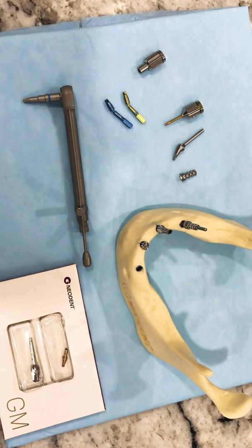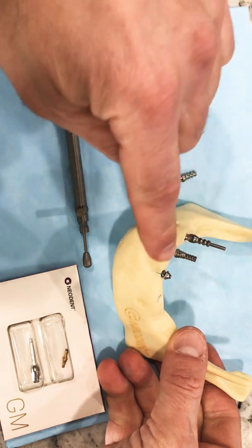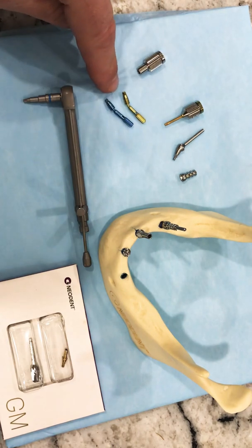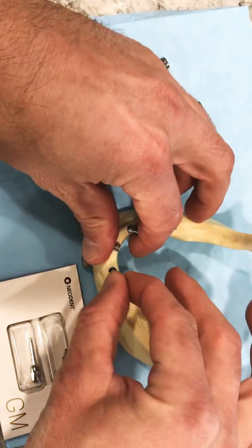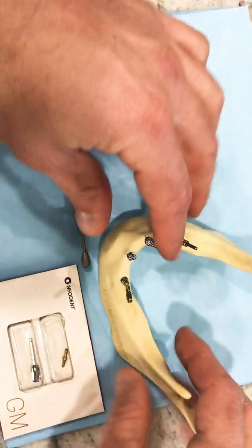Hi folks, I'm going to review a few things today. We're talking about full arch and placing our implants, putting the multi-unit abutments on and finding the correct angle. We have these new angulation pins that fit into the implant so that we can figure out the proper orientation of our multi-unit abutments.